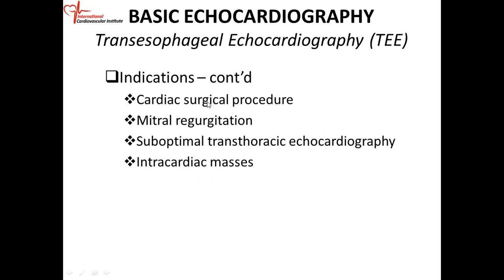A lot of surgeons doing cardiac surgery will not do the surgery unless they have transesophageal echo assistance. So if they're doing any type of valve surgery, say a mitral valve replacement or repair, they will do it under transesophageal echo guidance.